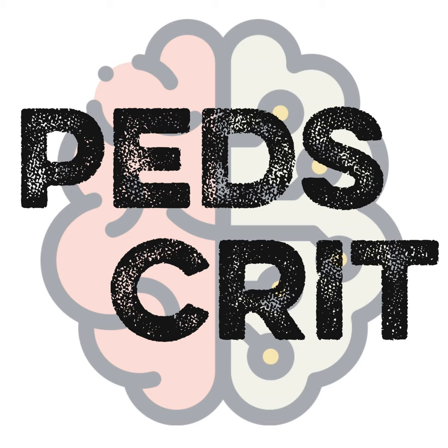Yeah. I think what you're alluding to is how VA-ECMO can actually increase your afterload, right? This leads to a sequence of events which all can culminate in florid pulmonary edema. That's when the question comes, if this patient needs a decompression, whether your LA needs to be decompressed or not. I think that's what you're alluding to, yes. Right, Jaya?